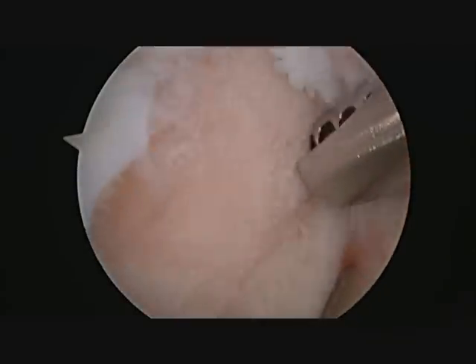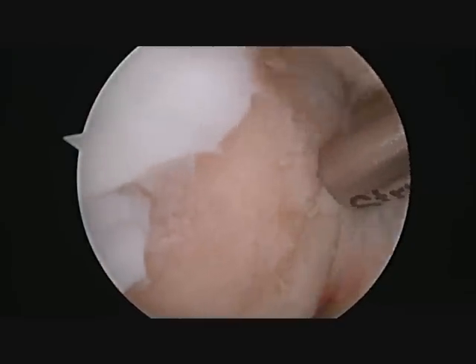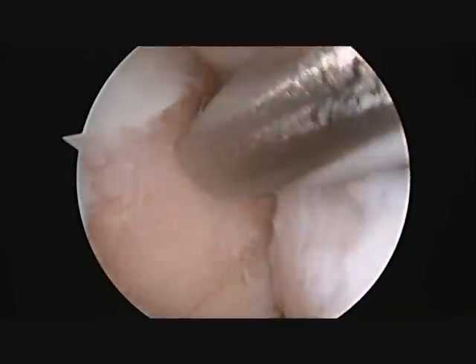Because of the size and location, this is an ideal lesion to be treated with microfracture. The shaver is removing all of the loose cartilage, and any cartilage that remains firmly attached to the bone will be left in position.